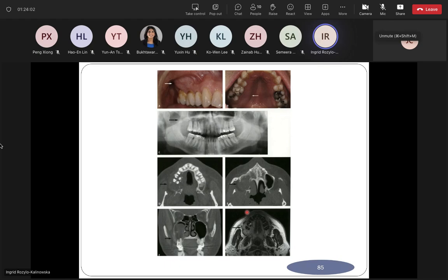And there's also a soft tissue tumor, so you can see the difference between the size of the tumor in soft tissues and what you can observe in the clinical picture. Sorry, a sip of tea.